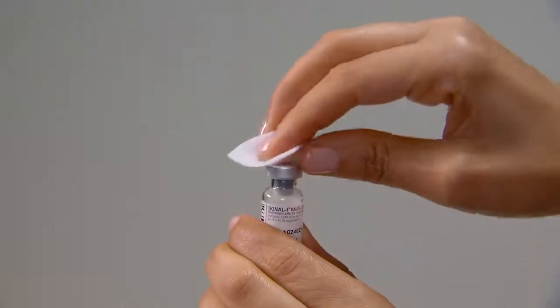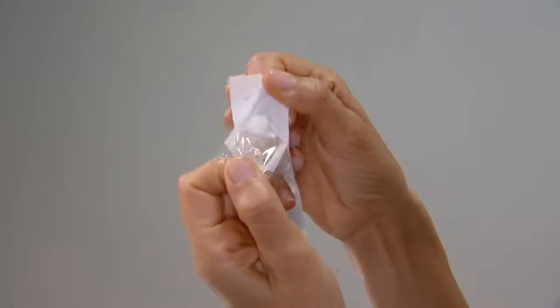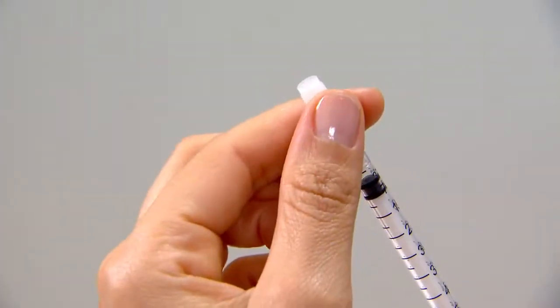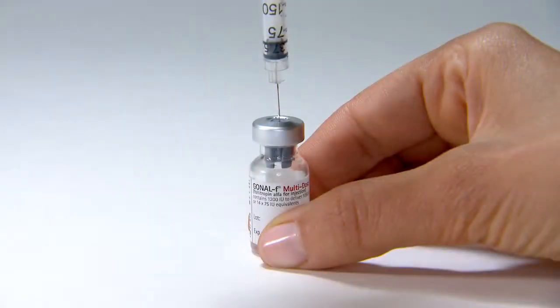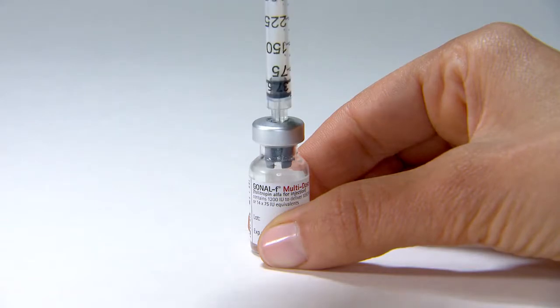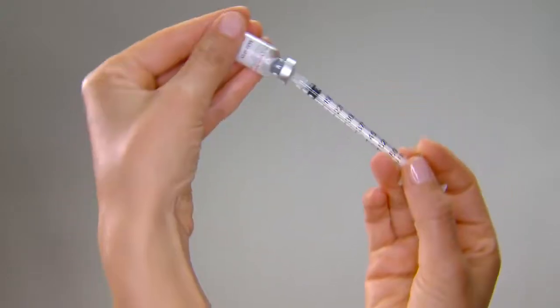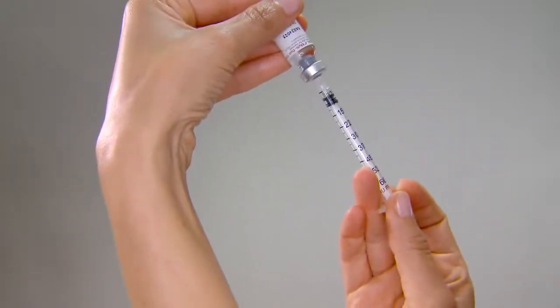Wipe the top of the vial with an alcohol swab. Remove the wrapper from the custom dosing syringe. Carefully loosen and pull the plastic cap from the needle. With the vial of reconstituted Gonal-F on a flat surface, insert the needle through the marked center circle of the rubber stopper. Without removing the needle from the vial, turn it upside down so that the needle points upward.